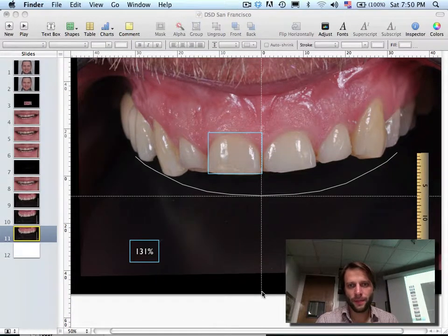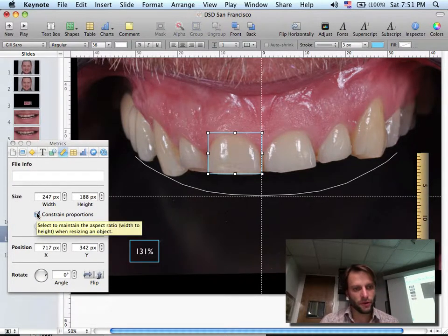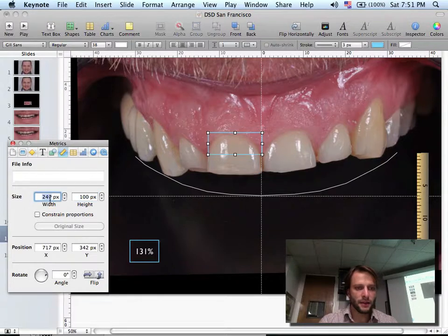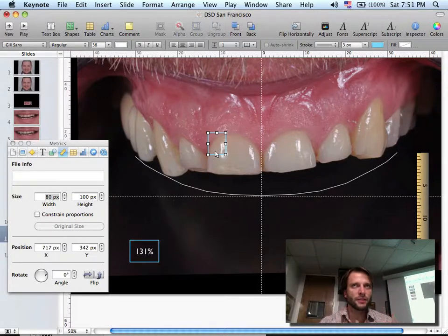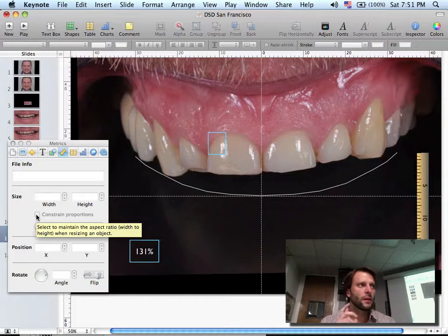The next step will be to measure or compare with the ideal proportion. So what I need to do is to click on the rectangle and change this proportion to the ideal 80% proportion. How do I do that? I have to unlock the proportion since I need to create a new proportion. So I will write 100 on the height and 80 on the width and click enter. When I click enter, I have this new little ideal rectangle. Once it's ideal, I can re-lock the proportion. So if I have a square and I need to change the proportion, I will unlock, change, create the new proportion, and then lock again.